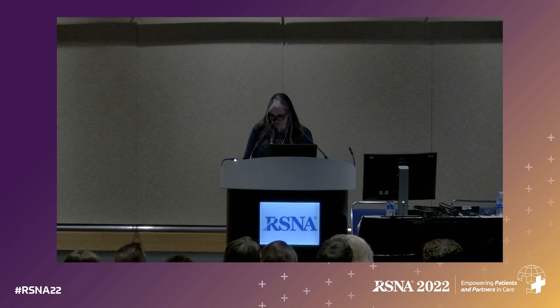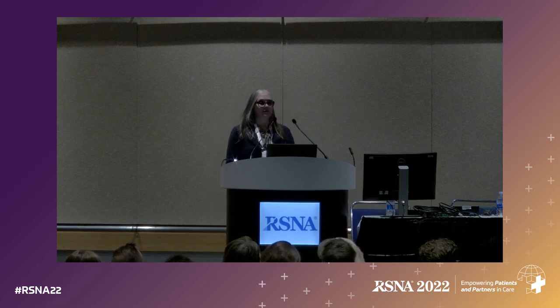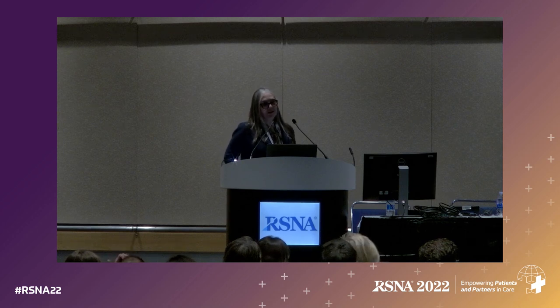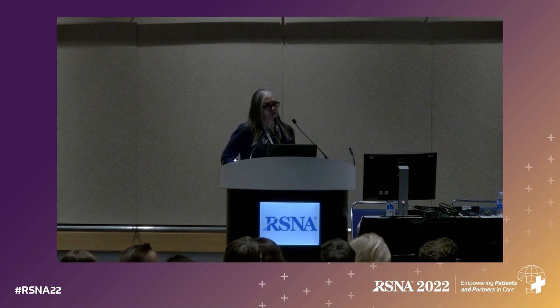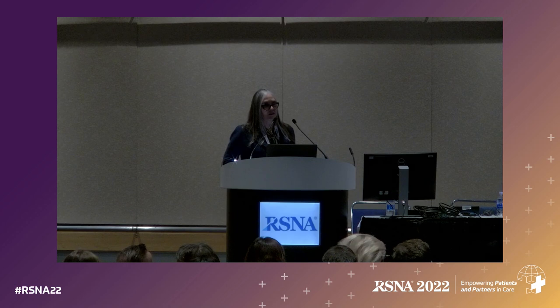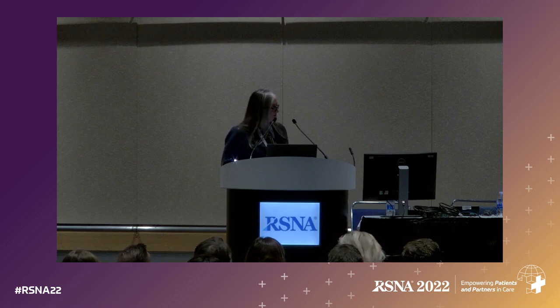Thank you. We do have one more question actually for you from online. Do you routinely use post-contrast sequences in the assessment of suspected diabetic foot osteomyelitis? Yes, we do. And the reason we do it is to help us outline the soft tissue findings. To call osteomyelitis, you certainly don't need contrast, but it does help when we're looking at the adjacent findings.